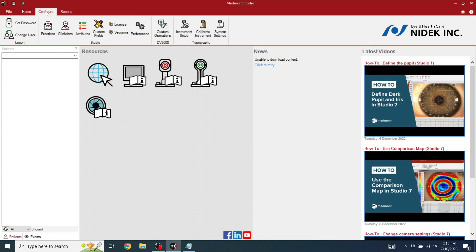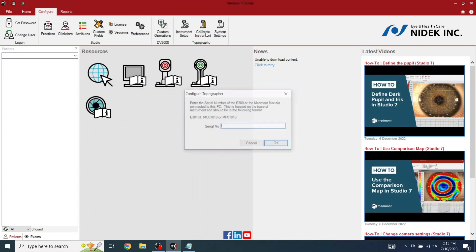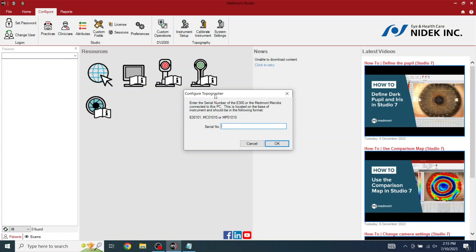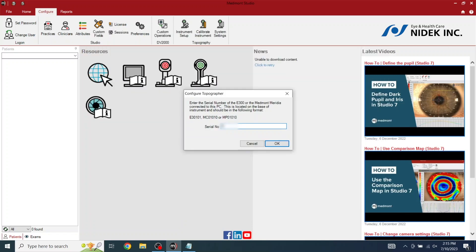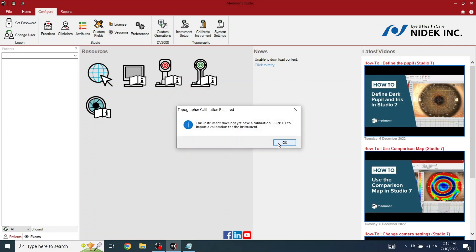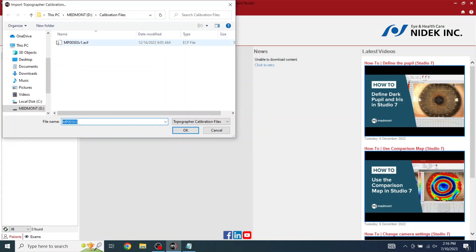Now we're going to select Configure. And we're going to calibrate the instrument. To calibrate the instrument, you must have the license or the serial number of the device. And that is found on the package that the USB drive is inserted into. And select OK. It does not have calibration. Click OK to import a calibration for the instrument. Select OK.